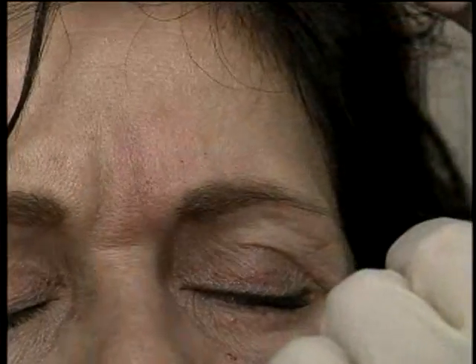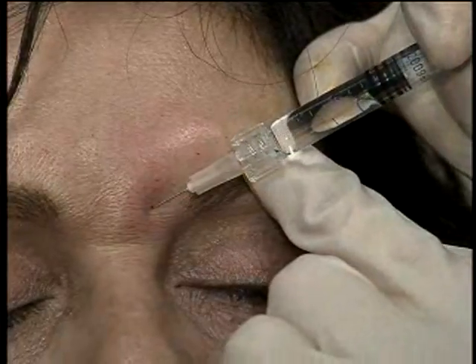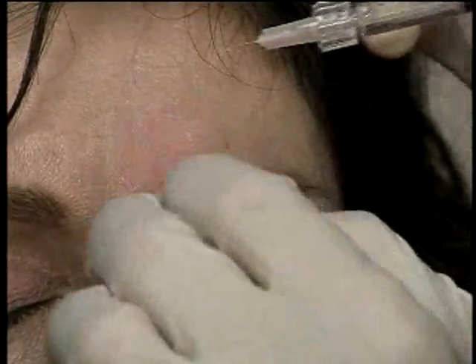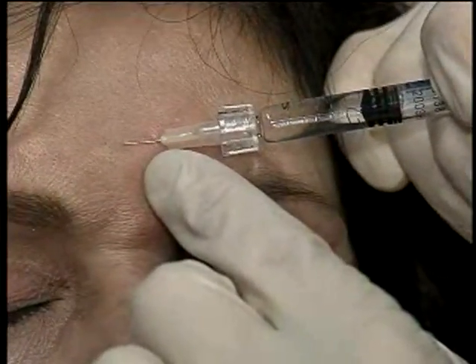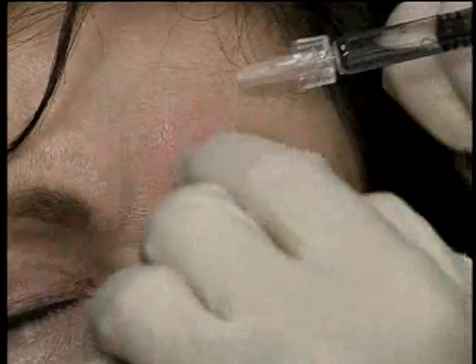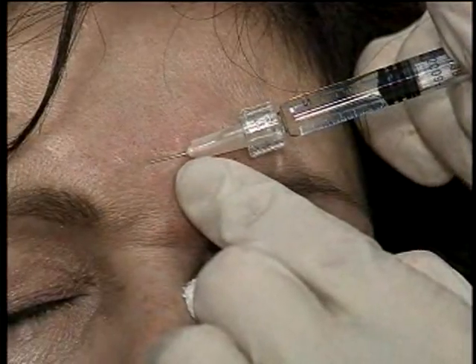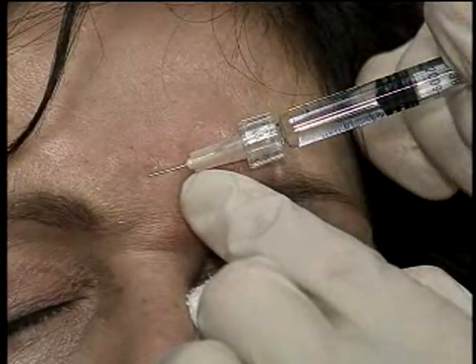See your frown? Good, relax. You can see how that's filling in very nicely. Now between this and botulinum toxin, she should be very happy with the result, and those creases should not be evident. So serial droplet method, just moving transversely along the crease, going slowly so as not to get a necrosis.